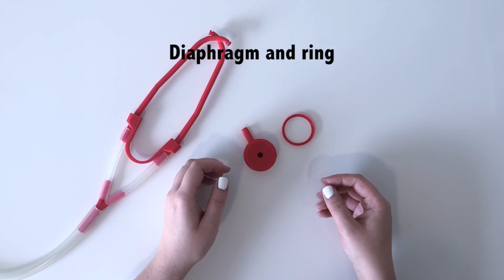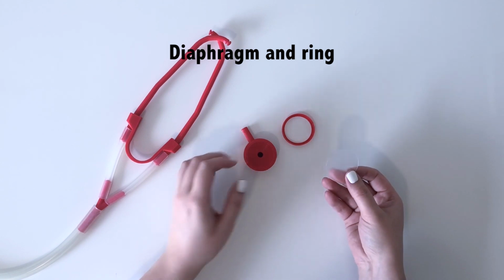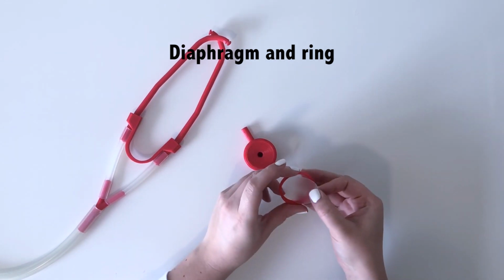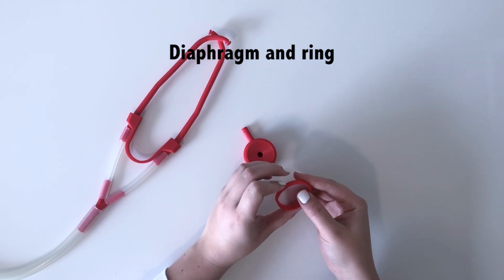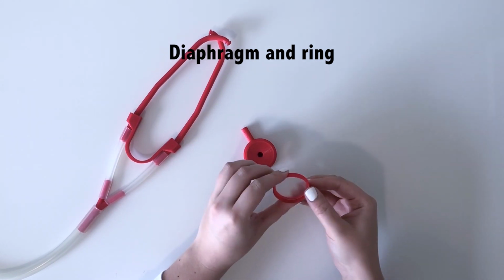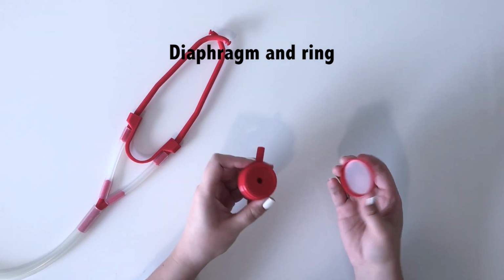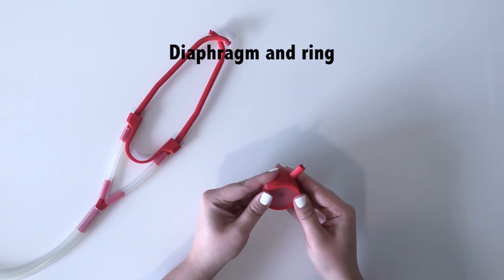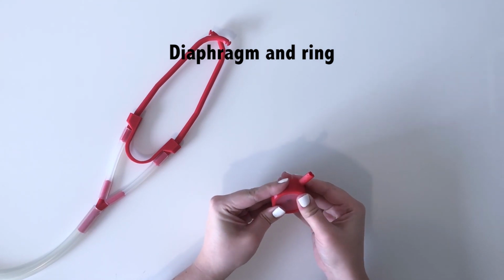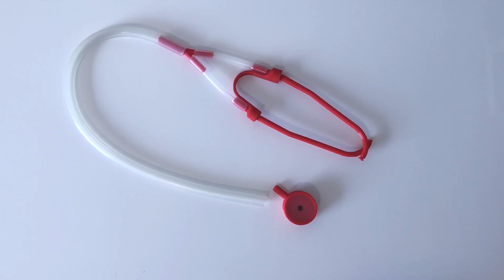To assemble the stethoscope head, first take the diaphragm and press it into the side of the ring with elevated edges. Next, click the ring with the diaphragm onto the head. Connect the large tube to the stethoscope head.